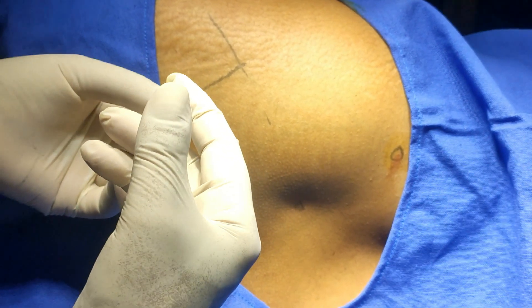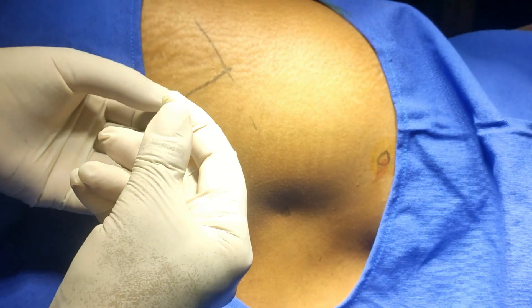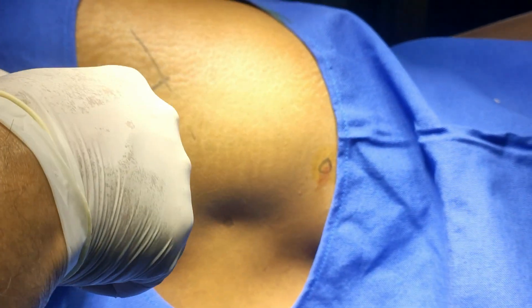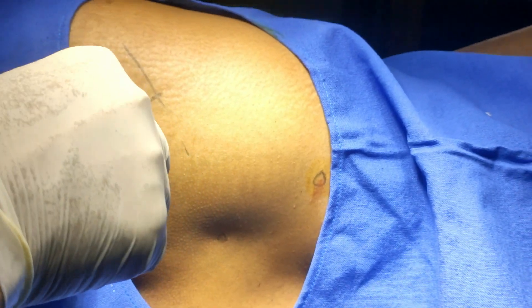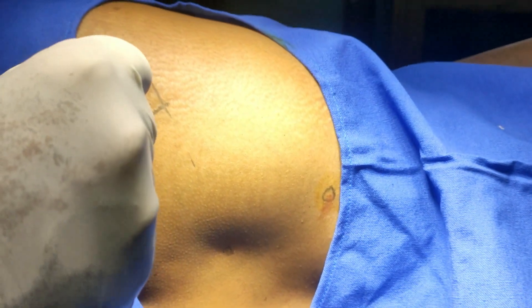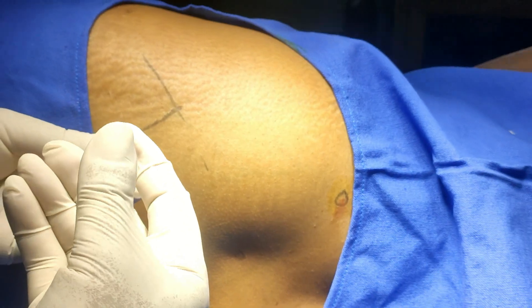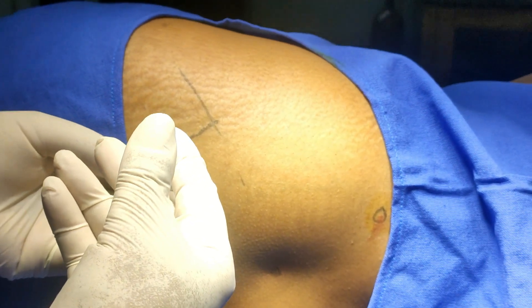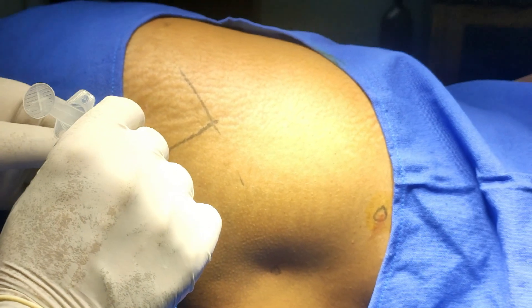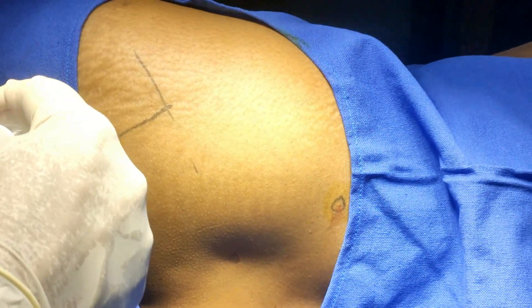Go deep down — this will strike the bone. Now this is the bony structure. Remove the syringe and aspirate, then inject 20 ml of the solution. I have now injected 20 ml of the solution here — let's check for any loss of resistance.